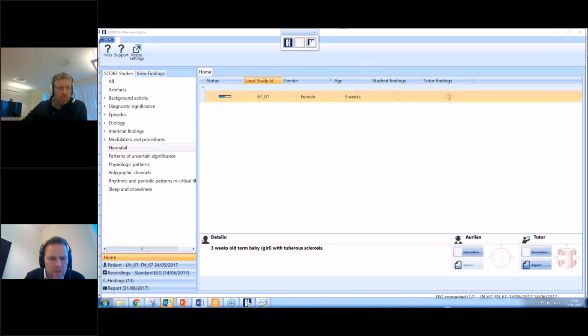Can we export the analysis, for example, as JSON? It's a question, Harald. In the educational platform, you cannot export directly, but in the hospital application, you can export the reports in different formats. You can export it as Excel or as PDF or RTF, but JSON we cannot directly export as it is for now.